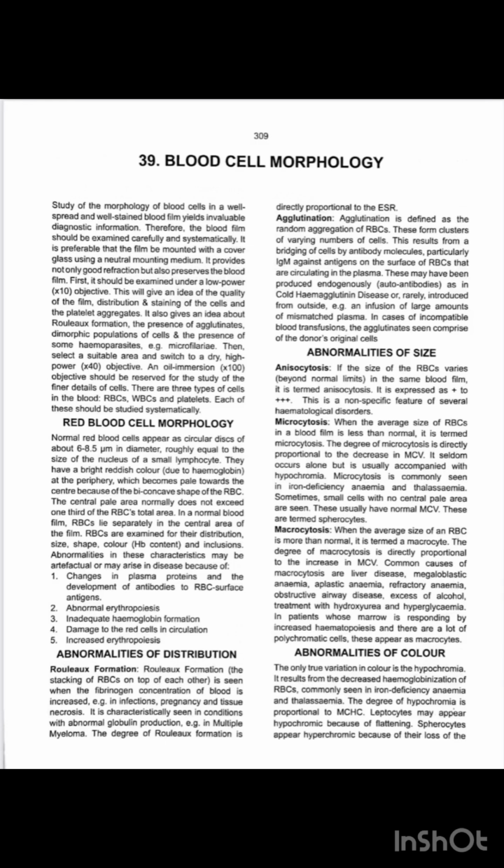The blood film should be examined carefully and systematically. The film should be mounted with a cover glass, and there should be a neutral mounting medium that provides good refraction and also preserves the blood film.